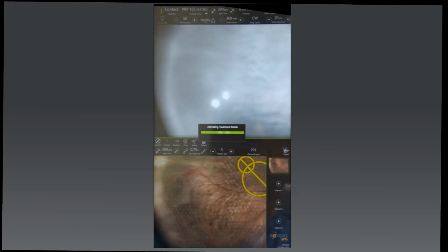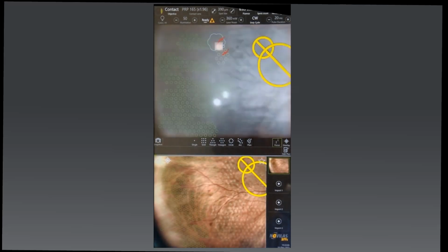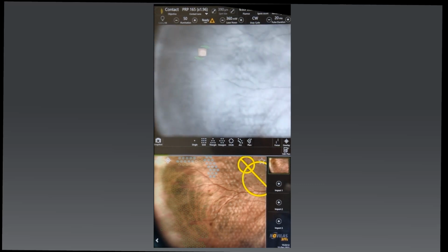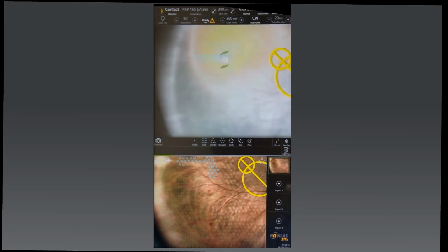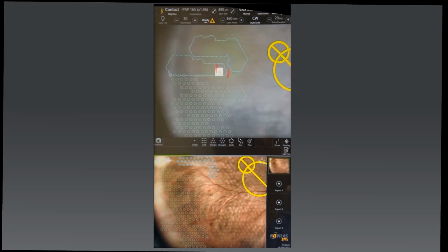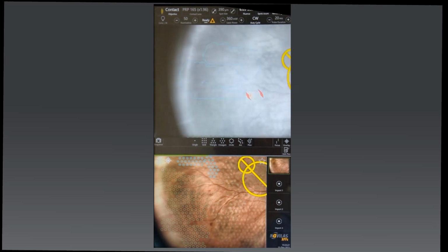Sometimes the more peripheral treatments the patients can be a little bit more aware of. So I'm titrating downwards a little bit here because there are one or two areas of slightly higher intensity burns. So I do titrate a little bit as I'm going around. I don't just stick the power at the same and keep going. I do modify it as needed. But it's very quick and easy to do. I mean, the control's quite near and accessible, so it's quite easy to do on the go.